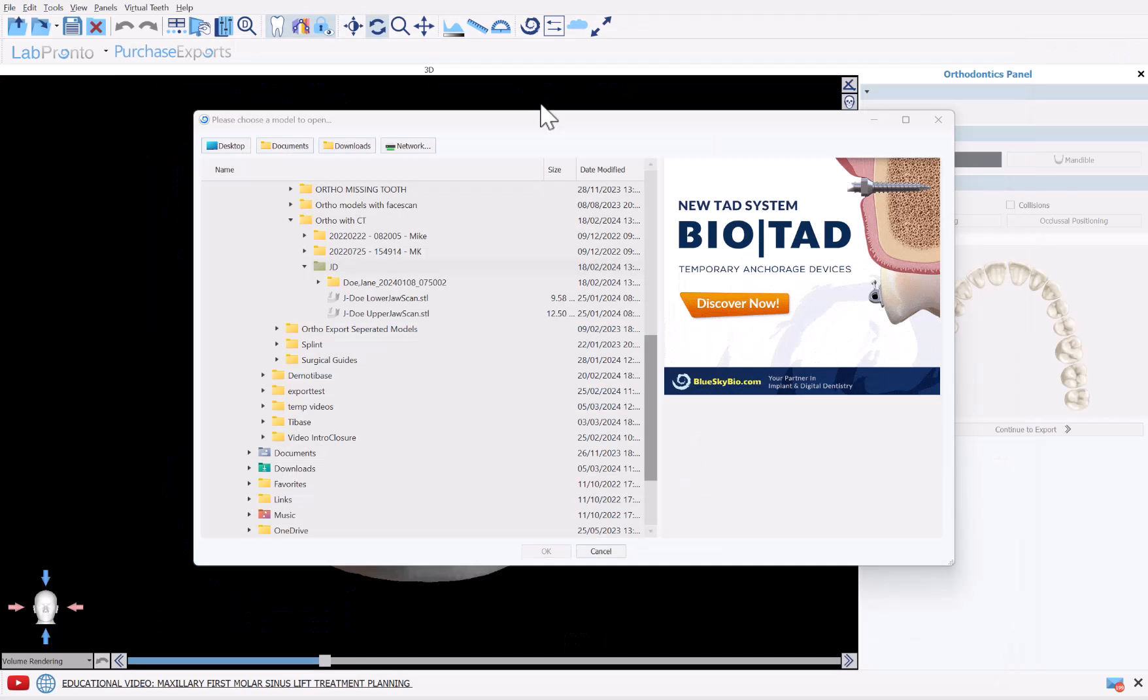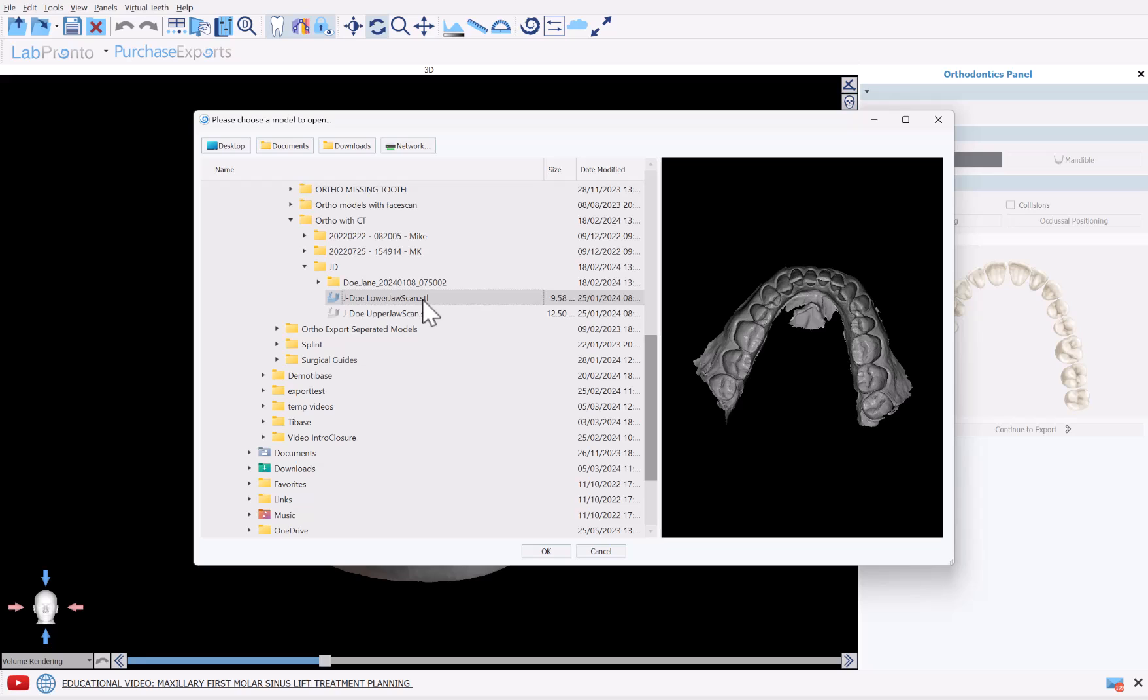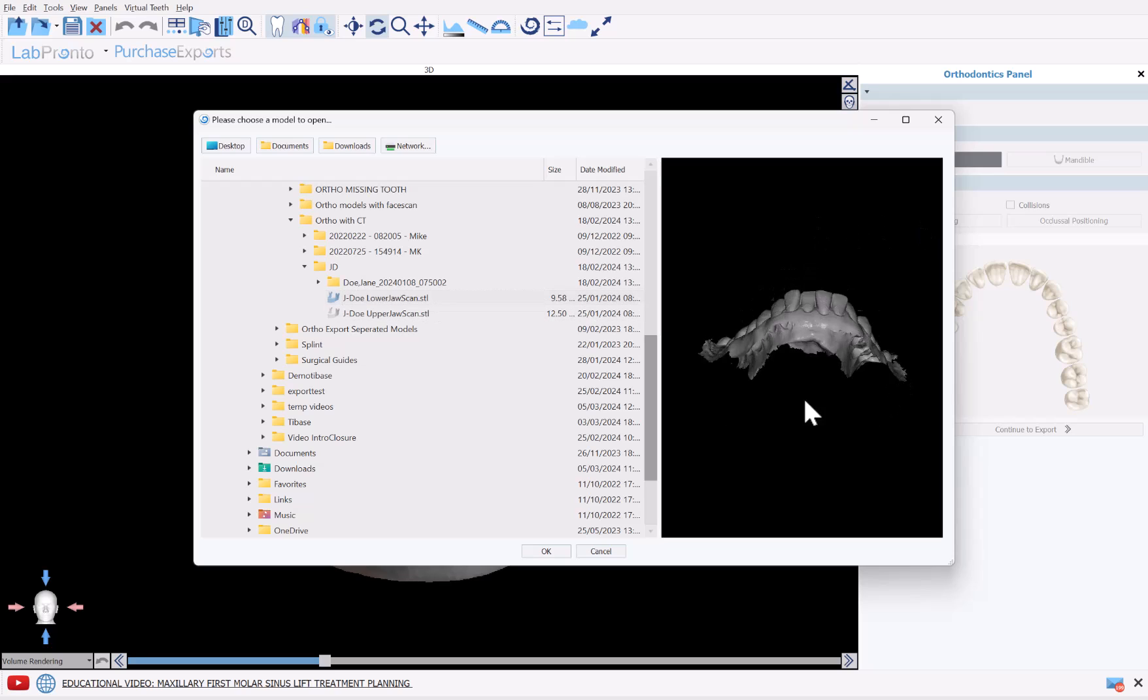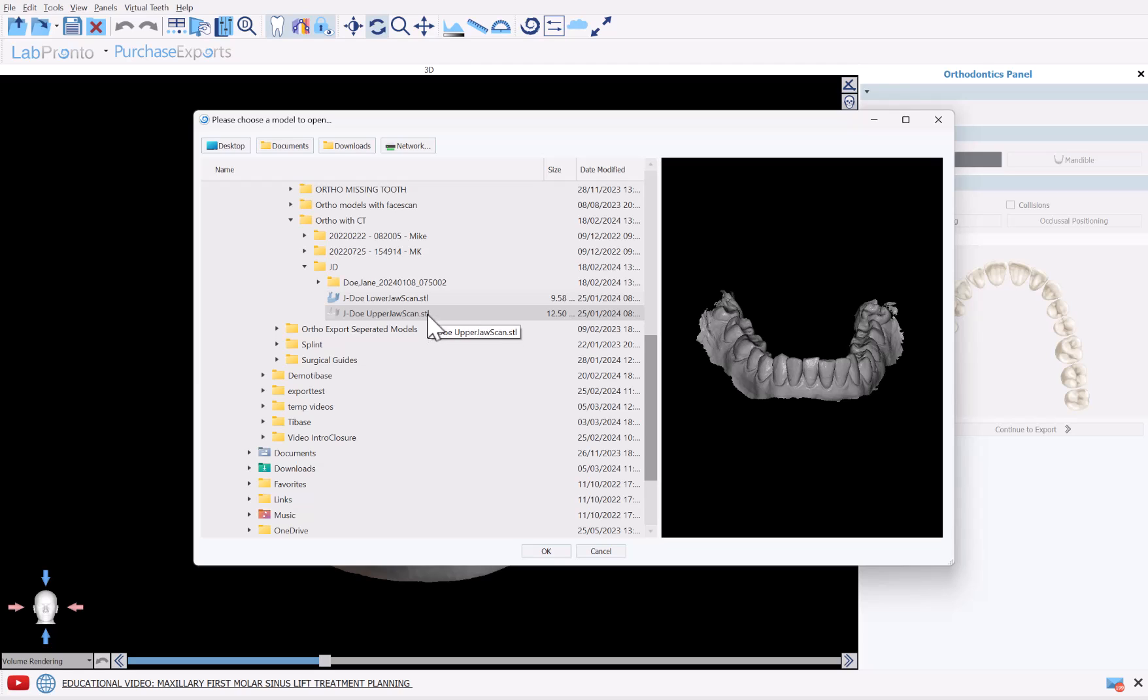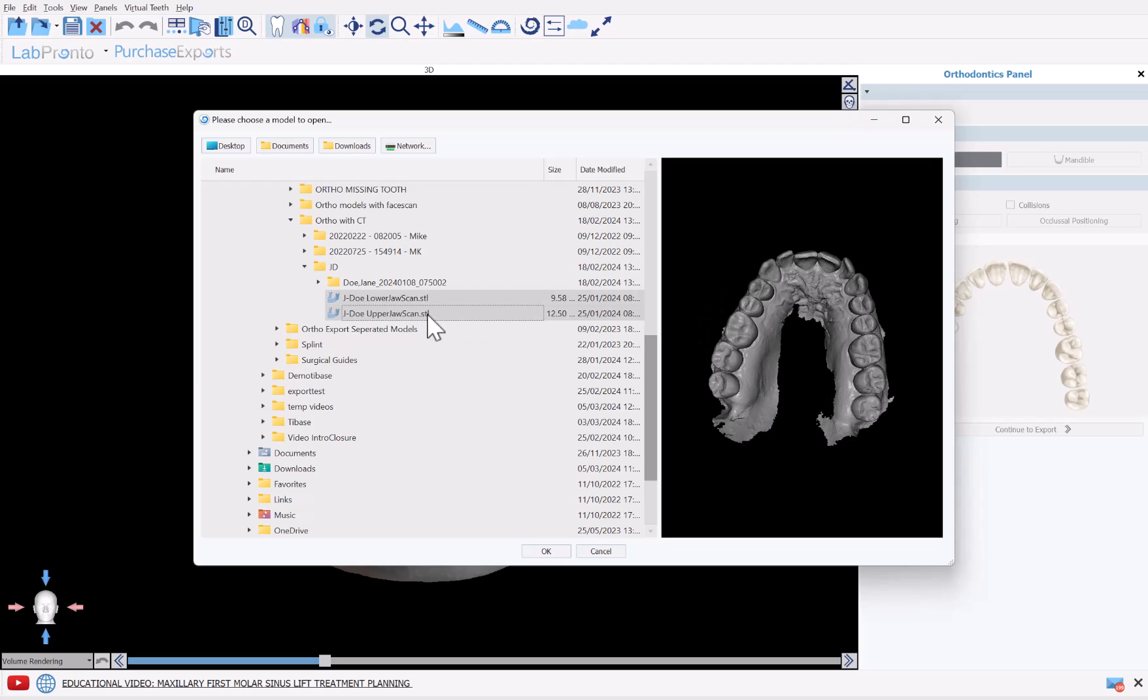The software is now prompting us to select the relevant optical scans. You can left click to select the relevant scan. Hold down the shift key to multi-select or the control key to multi-select, and while you're holding shift or control, left click on the additional file. Once the relevant files are selected, go ahead and click OK.